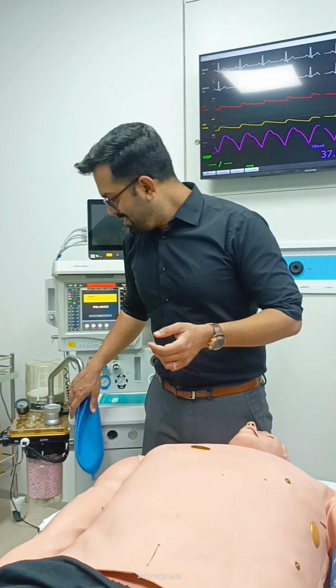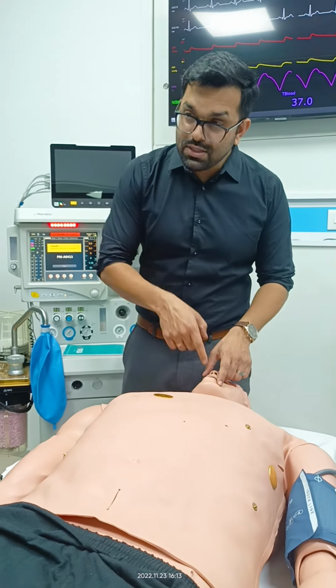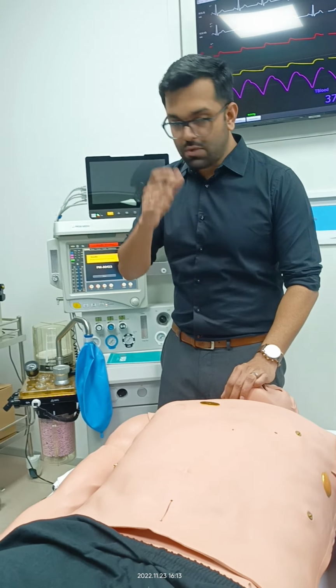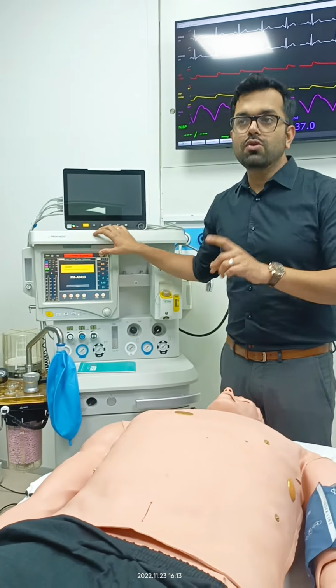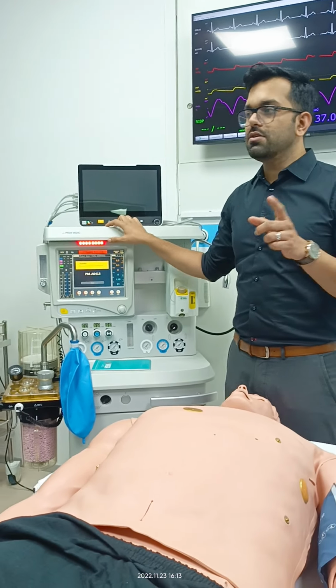So this is the patient, and you get two tubes which get combined, and once the patient is intubated, the tubes are connected to the endotracheal tube. Once this is done, to keep the patient alive, which gas is required? Oxygen. Very good. We need oxygen to keep the patient alive.